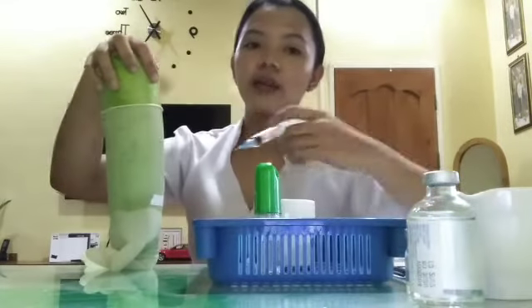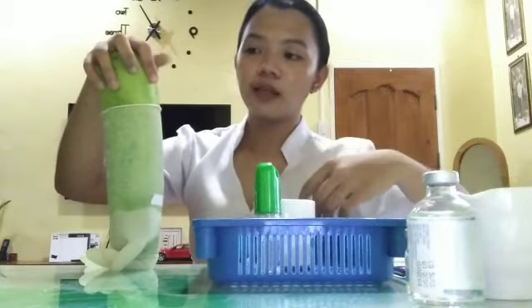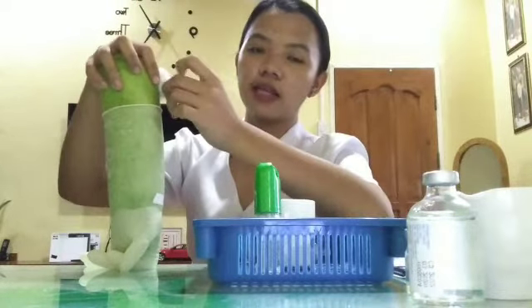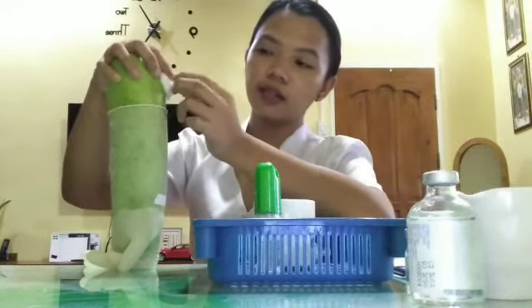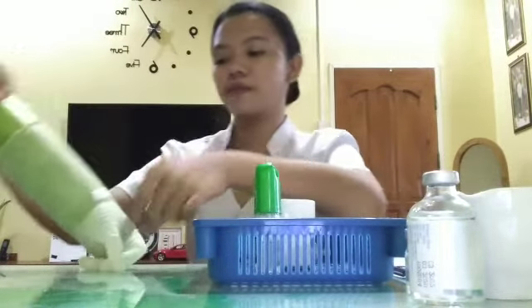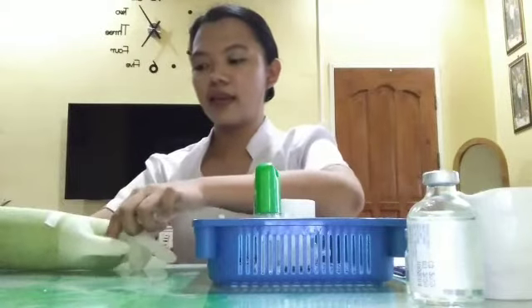Okay, after that we will put light pressure on it with a dry cotton.